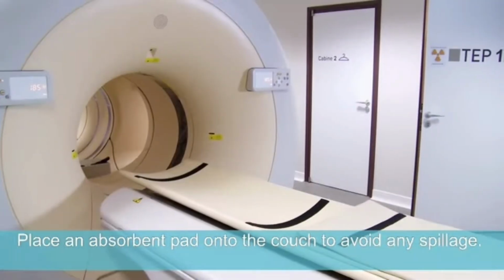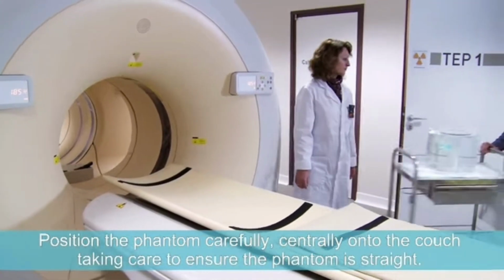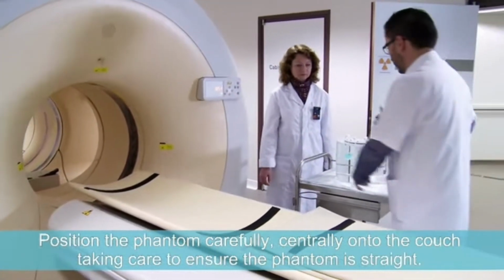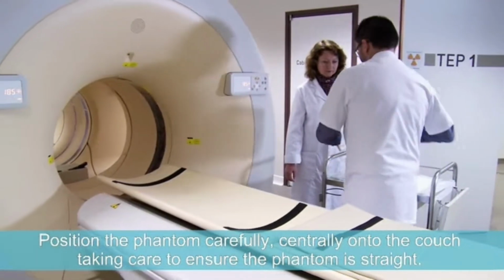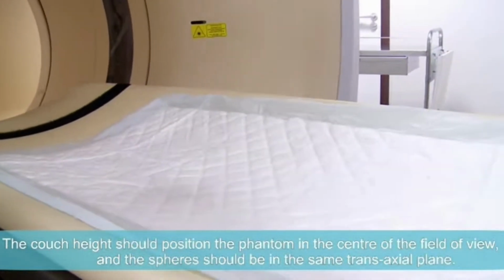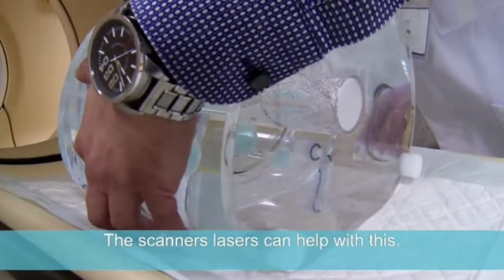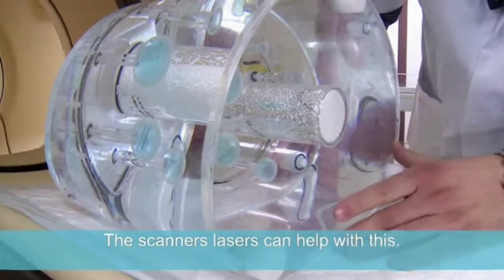Place an absorbent pad onto the couch to avoid any spillage. Position the phantom carefully centrally onto the couch, taking care to ensure the phantom is straight. The couch height should position the phantom in the centre of the field of view, and the spheres should be in the same transaxial plane. The scanner's lasers can help with this.